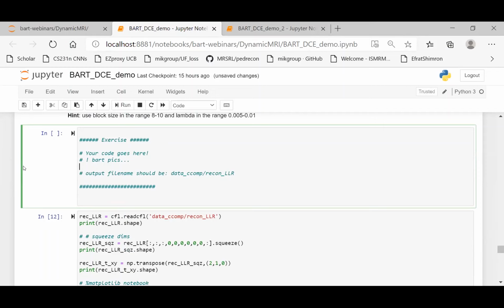So one question was if there's a difference between the transposed low rank matrix and the non-transposed, and because we're doing singular value thresholding, they give the same result.